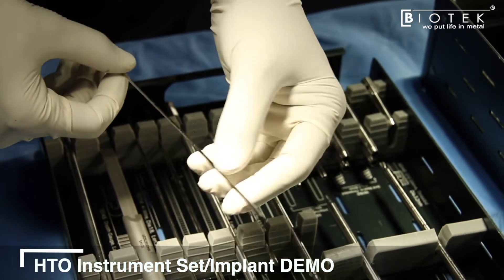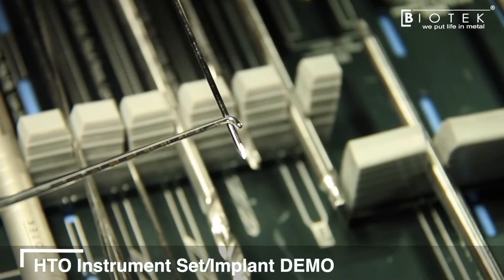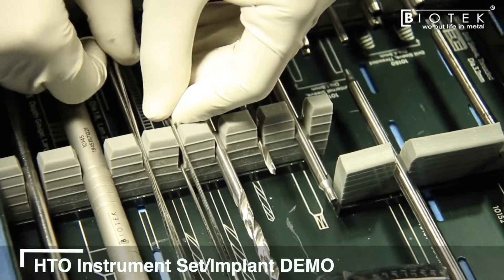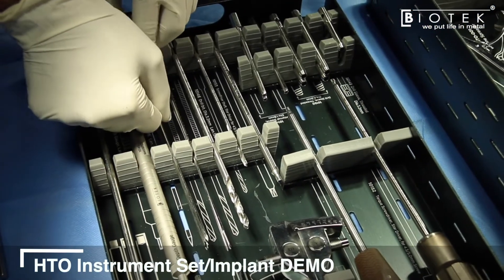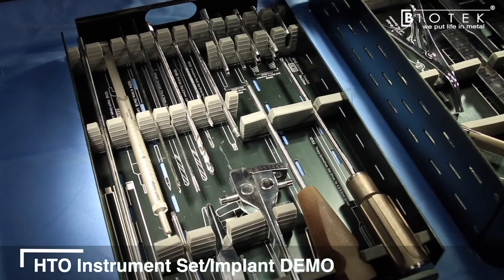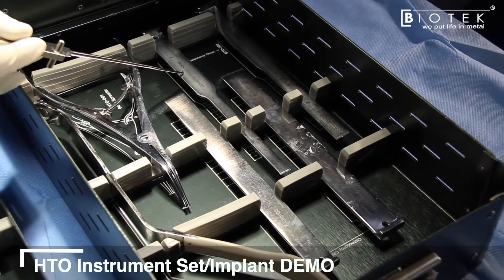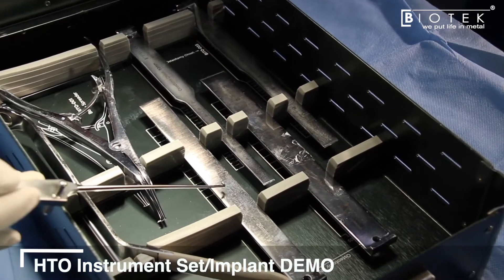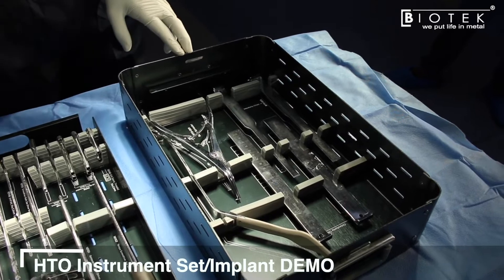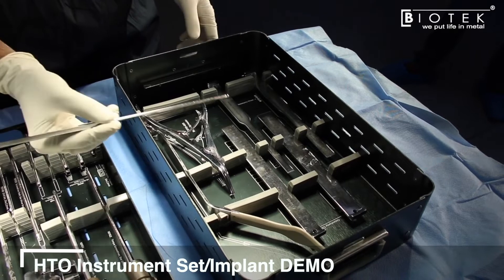Guide wires are available as non-threaded trocar tip in 1.8 mm or as a threaded option for slightly porotic bones. Once guide wires are in place and the osteotomy is performed with an oscillating saw, chisels are provided in 10 mm, 15 mm, 20 mm, and 25 mm sizes to complete the osteotomy to the desired length and ensure the posterior cortex is also addressed.